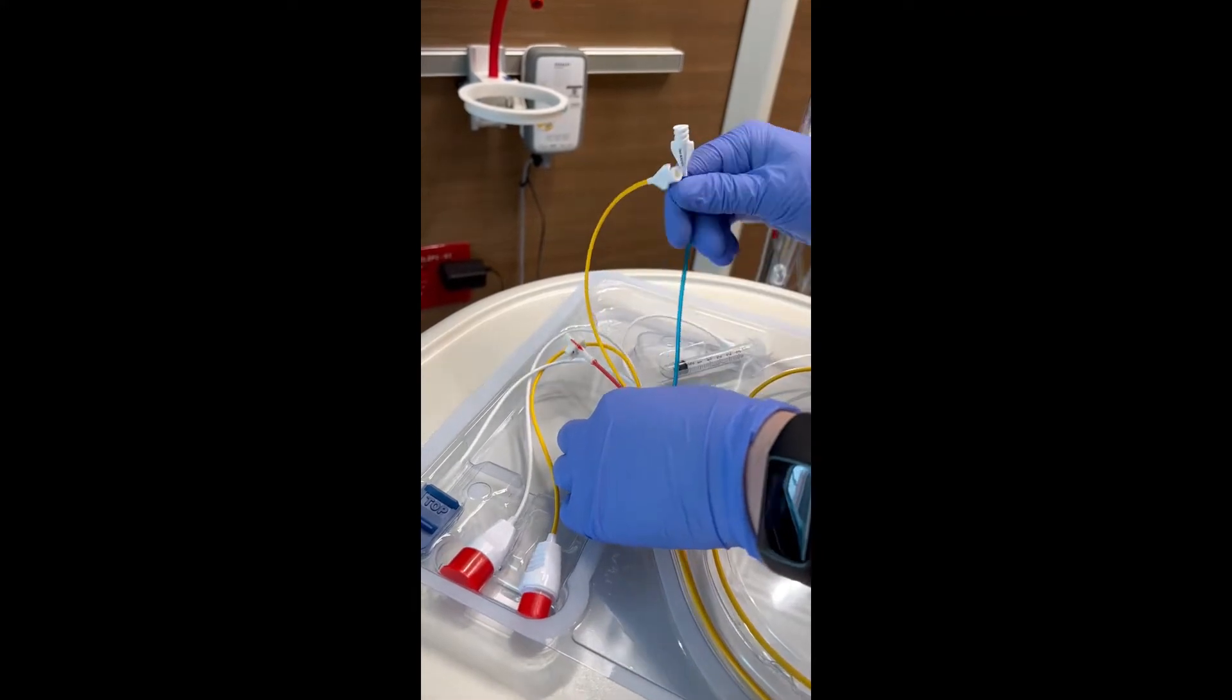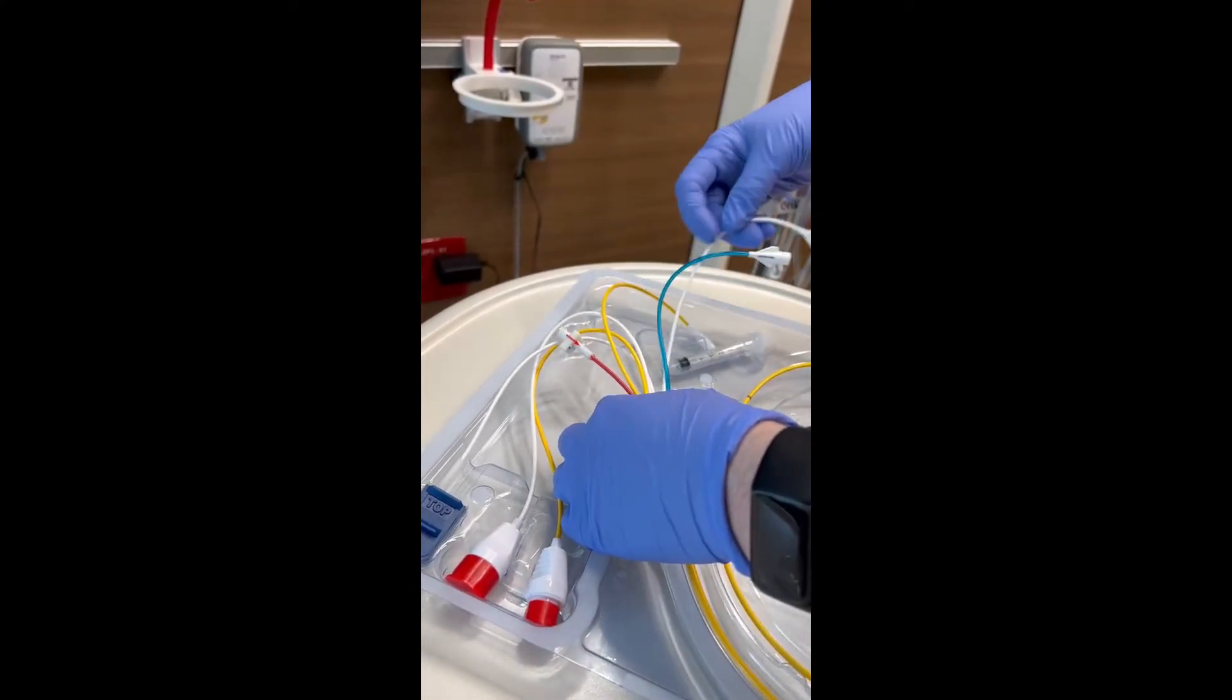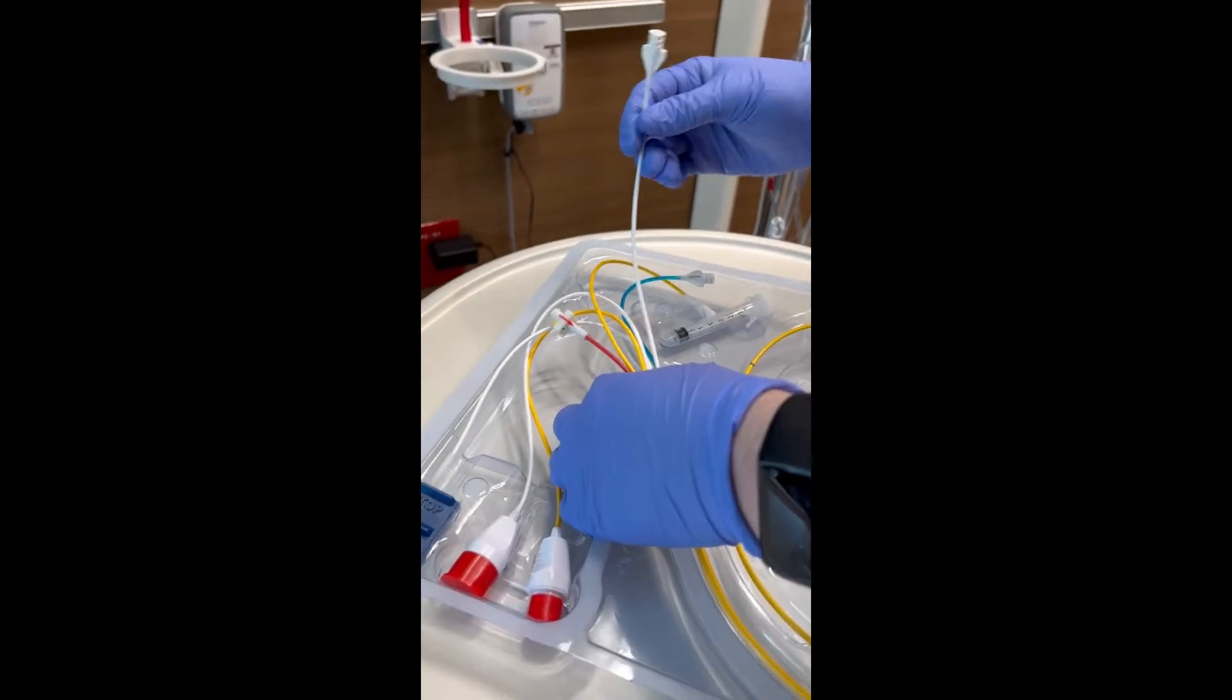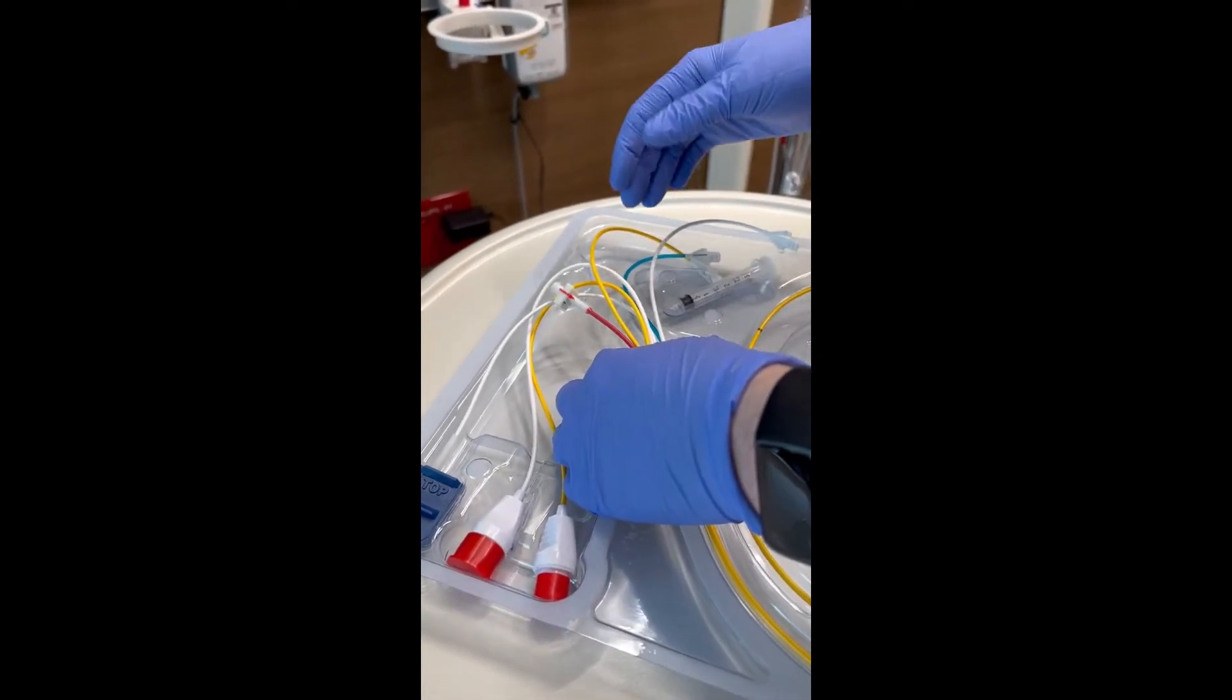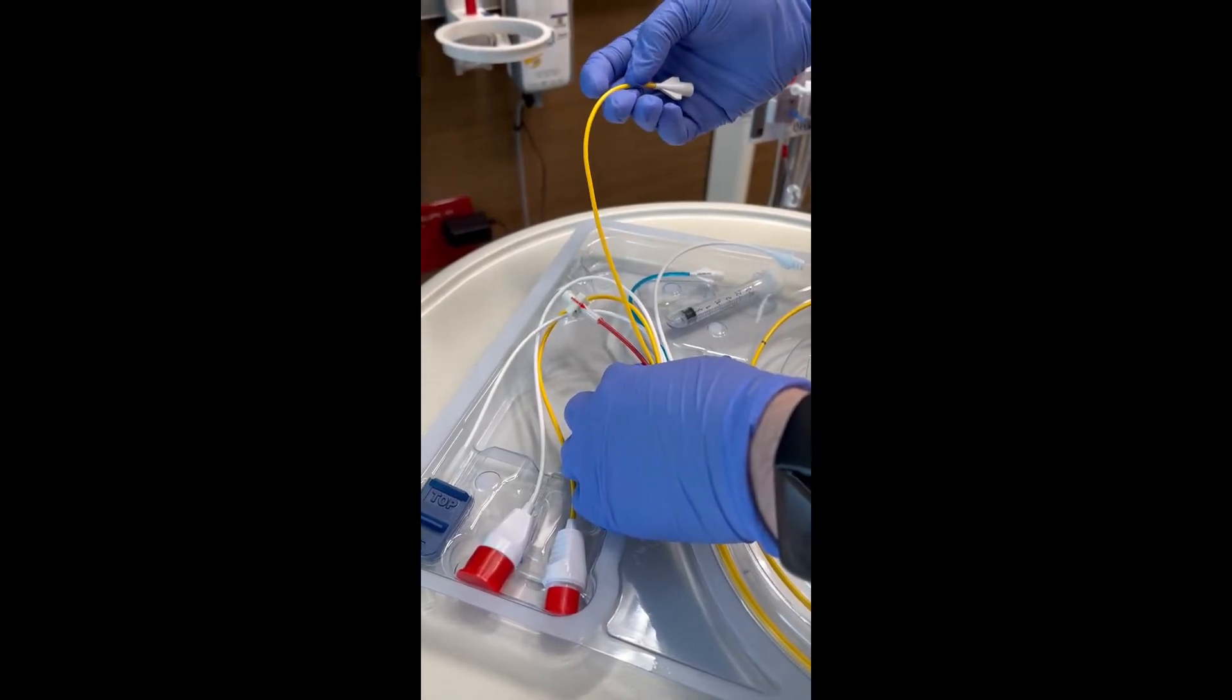Your blue is your CVP. This white one is an infusion port here, so you can hook your IV fluids or medications up to it. And then this yellow line is your PA catheter.